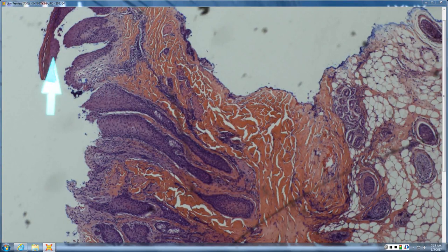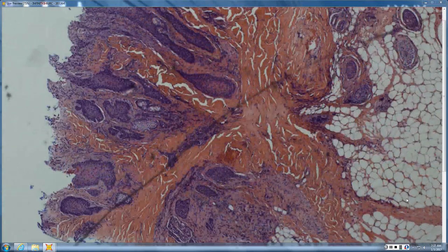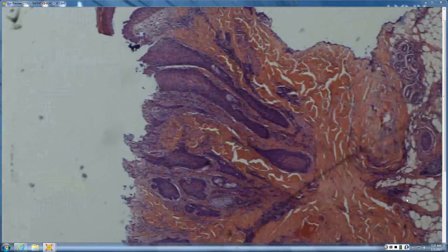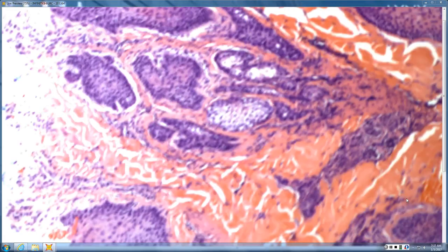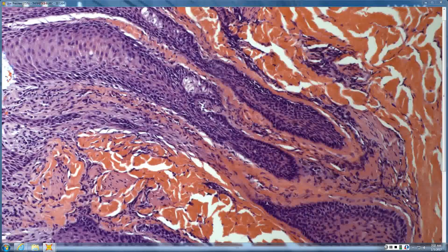Yeah, so the question is, is that artifactual or is that real? Not sure about that. The other cut looked like it was more real. There's a deep and superficial infiltrate kind of in the infundibulum and down by the isthmus as well. It looks lupusy to me. I was thinking that the separation was real, because it's such a lichenoid infiltrate. Yeah, lichenoid infiltrate can certainly give you a Max Joseph space type of split.